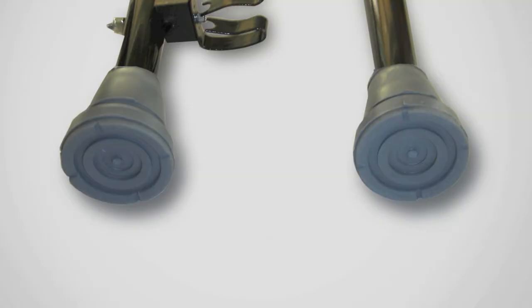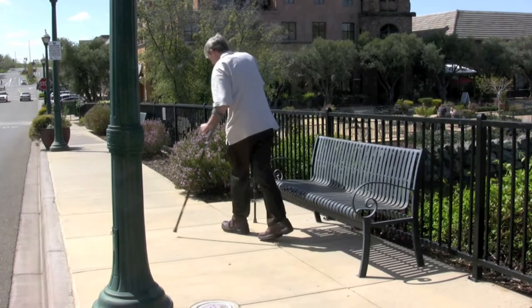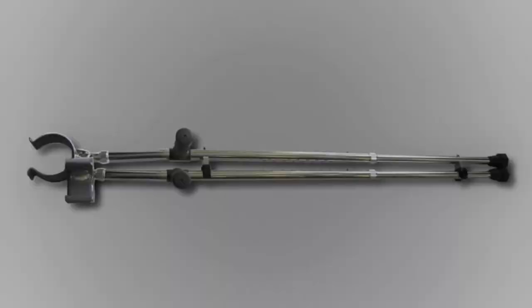Comfort — the tips offer increased shock dampening. If you're on your crutches for an extended period of time, this feature can really be appreciated. If your balance is questionable and you encounter a wet surface, you want all the traction you can get.